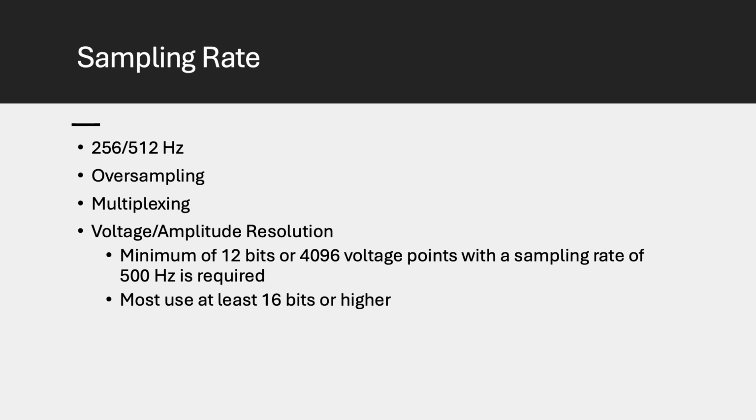The number of data points may be further reduced by amplifier or application control software depending on relevant physiological characteristics related to the actual rate of signal change. And this allows for storage constraints to be met. The final result is accurate and a noise-free representation of the original signal at the desired electrode pairings, sensitivity, and filter settings.